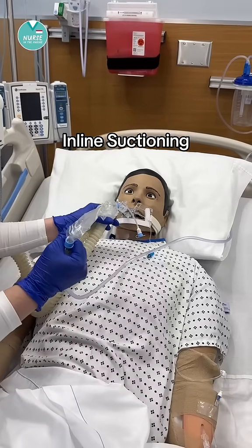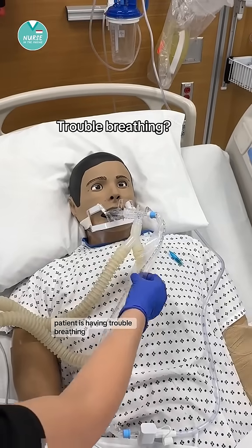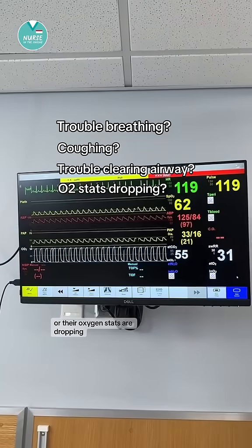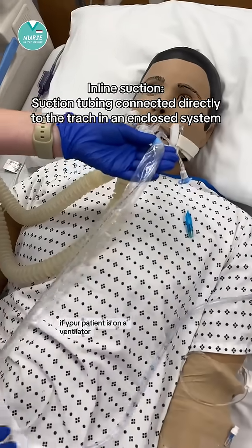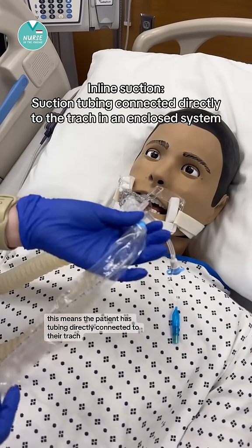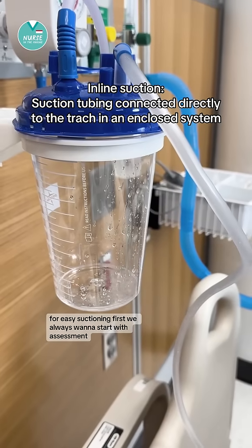Let's talk about in-line suctioning. If your intubated or trached patient is having trouble breathing, coughing but having trouble clearing their airway, or their oxygen sats are dropping, they may need to be suctioned. If your patient is on a ventilator, they will have in-line suction set up. Some non-vent patients have this as well. This means the patient has tubing directly connected to their trach for easy suctioning.